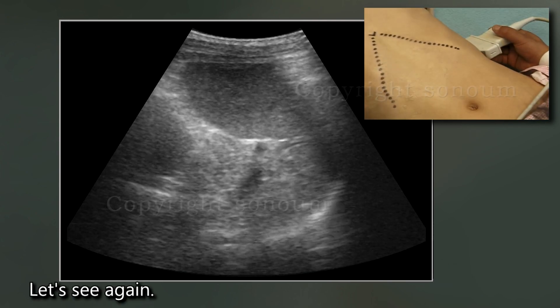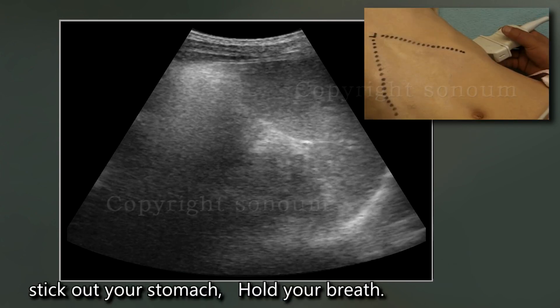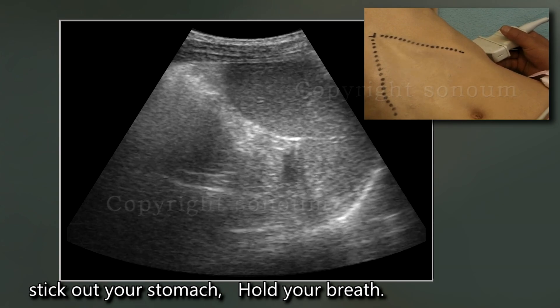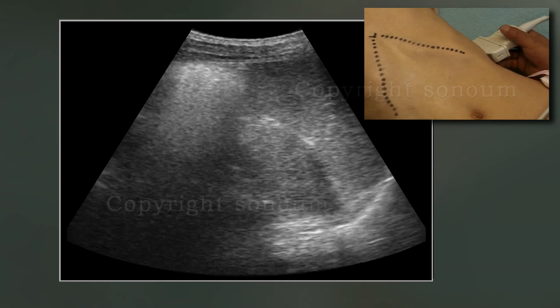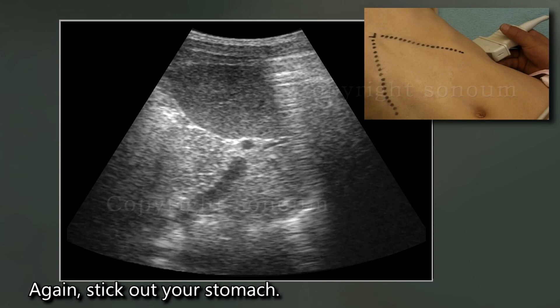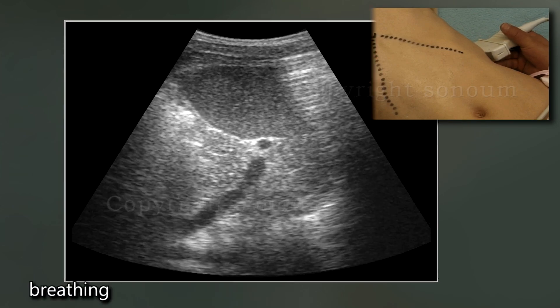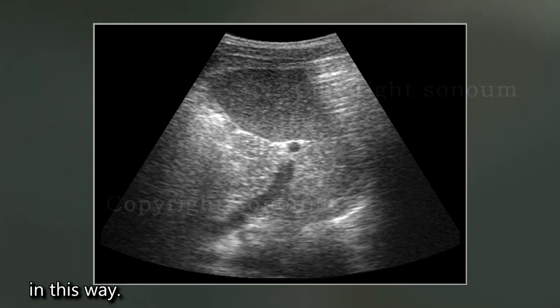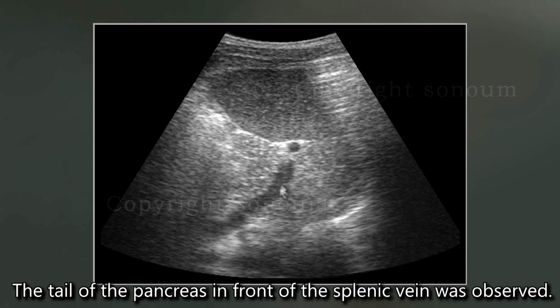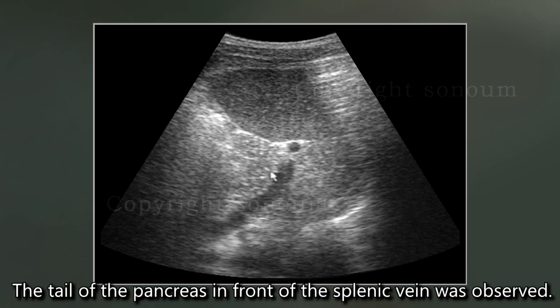Let's see again. Ask the patient to stick out their stomach and hold their breath. Again, stick out your stomach and breathe. In this way, the tail of the pancreas in front of the splenic vein can be clearly observed.